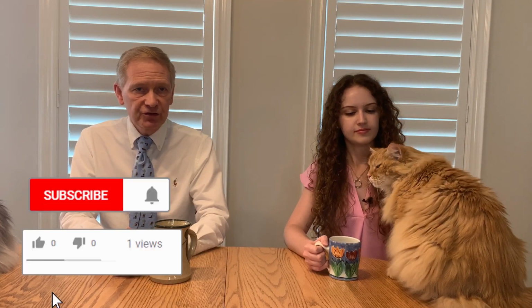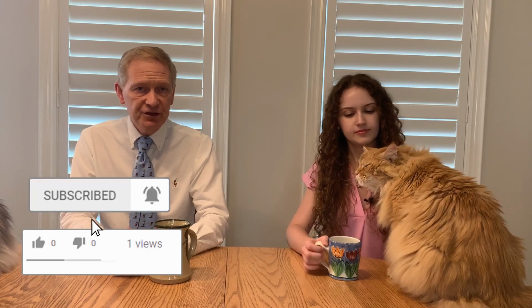Now, the accuracy of the test is approximately 85%. It's the same as if you have a cardiolite or MIBI or thallium type stress test, but at about a third of the cost and without radiation exposure. It provides a lot more information than the myocardial studies using thallium or MIBI because it tells us a lot about structure and function of the heart. It's also a much faster test. The test generally takes 45 to 50 minutes.